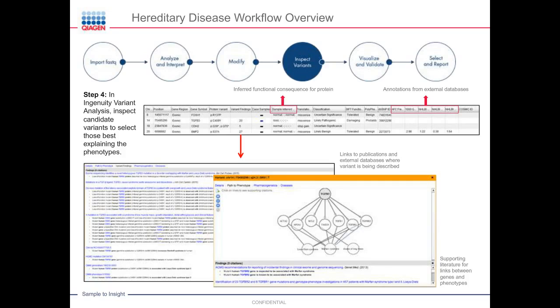Okay, thank you for that. And once again, our next question is actually a two-parter. The first question asks, what tools are used to associate genotype and phenotype? Yeah, so it's a self-built tool in variant analysis, which uses the content from the knowledge base. In the knowledge base an ontology is used, which makes associations between genes, phenotypes, diseases, but also gene-gene interactions, gene pathway information and others.